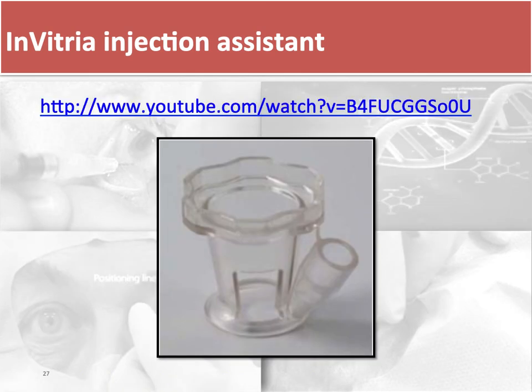This side tube maintains the scleral entry site to be 3.5 mm from the limbus. It is widely used in the UK because injections are commonly done by nurse practitioners, thus ensuring fewer complications and standardizing the injection technique.